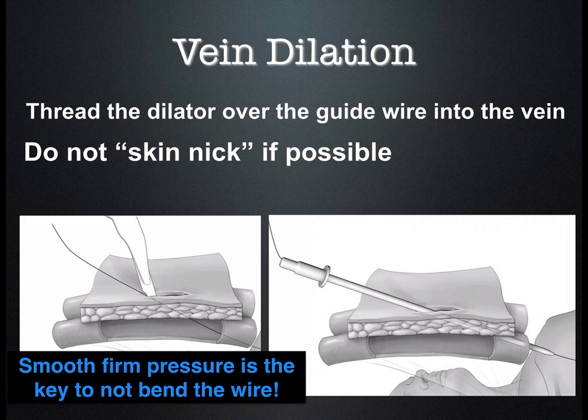The other thing is we want to try and prevent as much infection as we can. So anytime we traumatize the skin, we are increasing our risk of infection. So the best practice is not to use the scalpel unless we absolutely have to. The other thing is that we have to stop bleeding. And if we use a skin nick, we may have excess bleeding that we have to wait for it to stop. So not using the skin nick is the best practice. Sometimes you will still need to do this, but just remember, if you don't need to, don't do it.